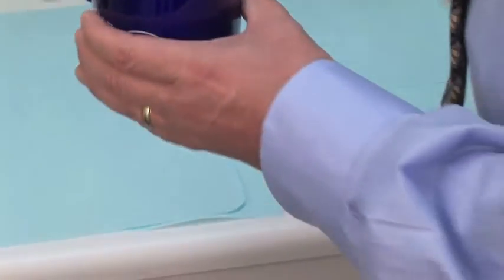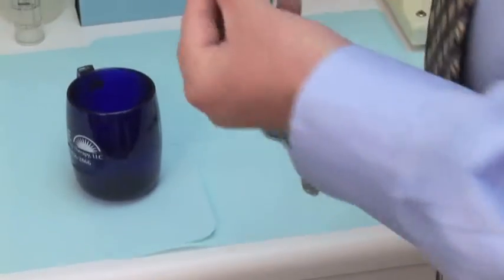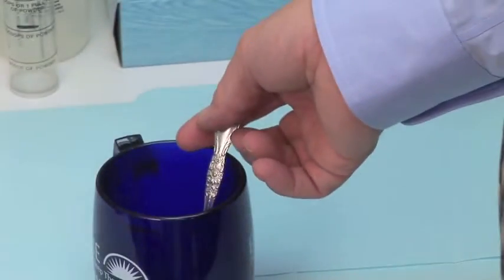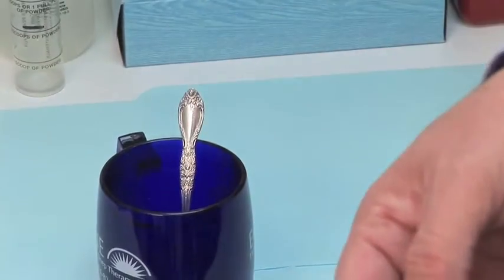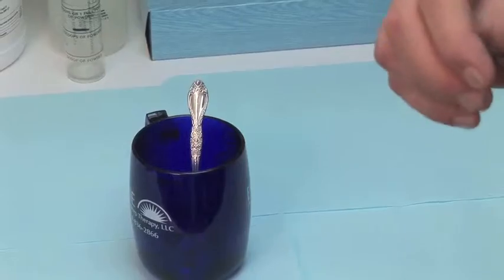Our material has been in the microwave for two minutes, and you can see it's very thermoplastic in nature. I've molded this into just a small rectangle. I can place it back in the water to keep it warm until we can place it in the patient's mouth, and that's what the next step will be.